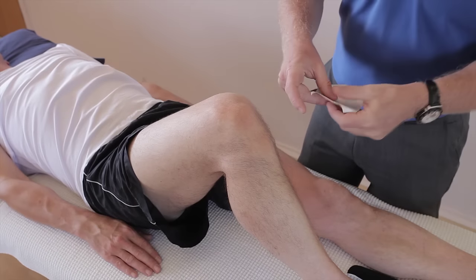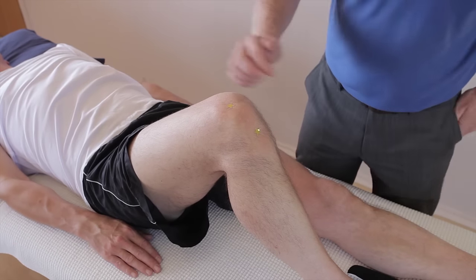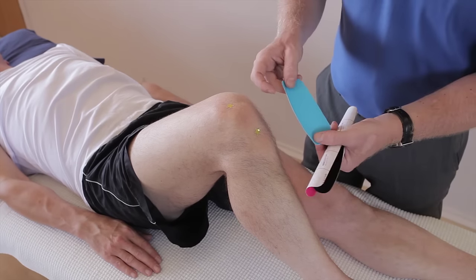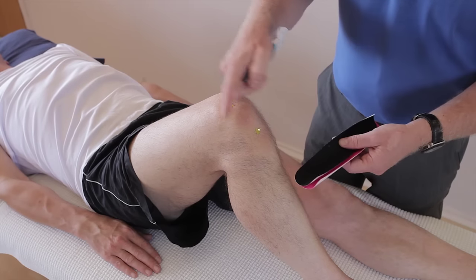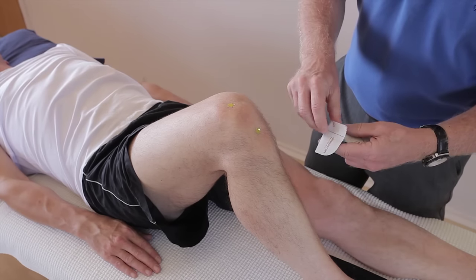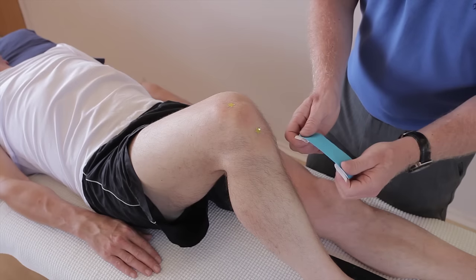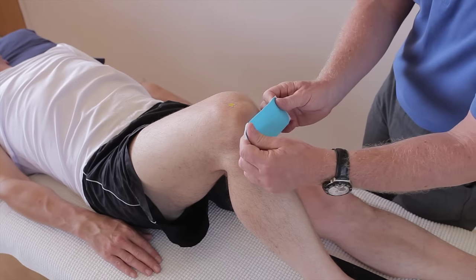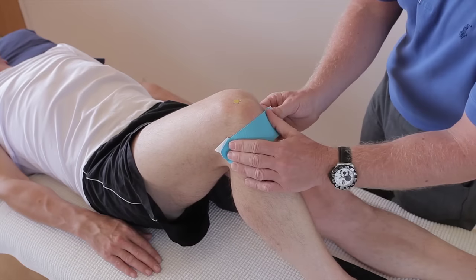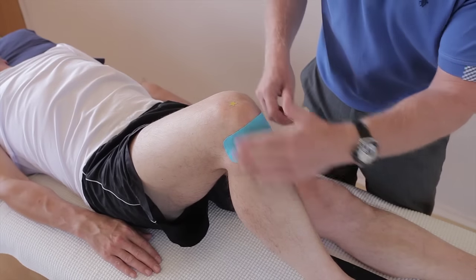So let's say they have pain inferior on the tendon area, and they've also got a bit of pain around the actual patellofemoral joint itself. For the first application of the tape, we've got a small eye strip. Fold it in half, then split the tape, and hold it with your thumbs directly across this area at 100% stretch — back off a little bit, so between 75 and 100%, crossing over that area of pain. This eye strip doesn't want to be too long, because it'll end up going behind the knee and potentially irritate. So that's the first application.